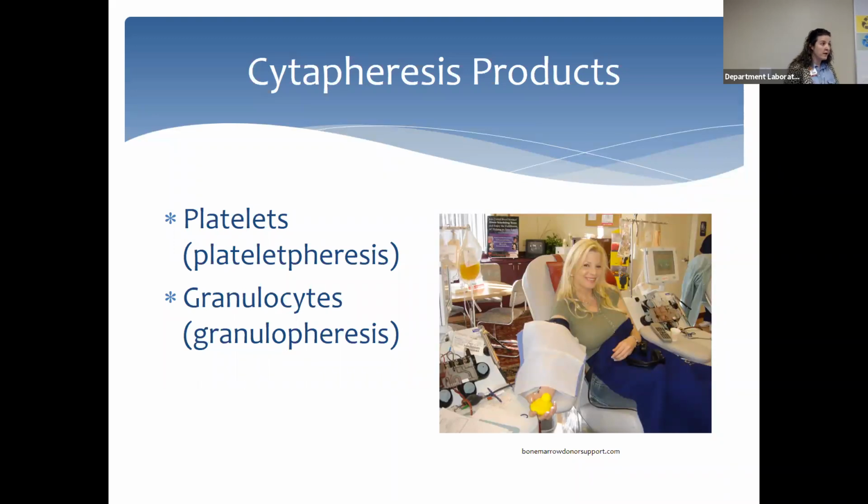Remember, when you enter the unit of red cells, because it's kept at refrigeration temperature, that expiration is 24 hours, okay? Platelets are the #1 product that's going to have bacterial contamination. If you do the statistics, it's always platelets that are involved when recipients become septic, okay? Because they're stored at room temperature, right? They're the #1 culprits that are involved in sepsis, right? So when you pool platelets, because you're accessing the mother bag and you're pooling all these donors together, your expiration date changes to 4 hours from pooling, all right?